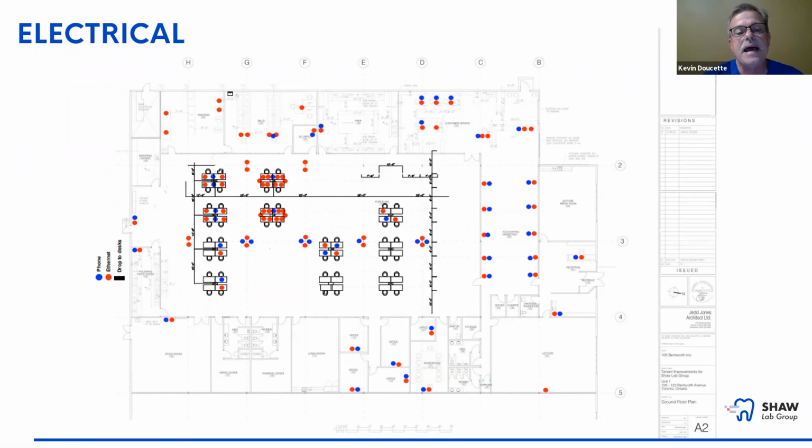You can see here, the actual laboratory was developed by myself, Ali Razi, the owner, Mike Lino, laboratory general manager. We consulted with very many experts in the field in going through how to best be able to handle growth of the future. You can see this layout here. It's pretty much laid out in a cell format that we can propagate as we grow, as we need to. As work expands, we drop in another department, another system.